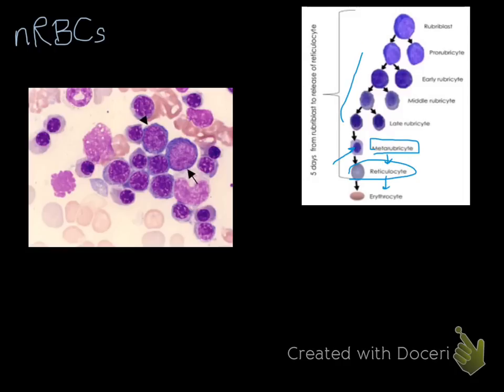These earlier erythroid progenitors you almost never expect. They're also called nucleated red cells, but you don't expect those earlier forms. This picture on the left is actually a bone marrow with erythroid hyperplasia. All of these cells I'm circling are metarubricites that are more mature, and these in here are the less mature red cell progenitors. There are different stages of rubricites, and even a rubroblast is in there as well.